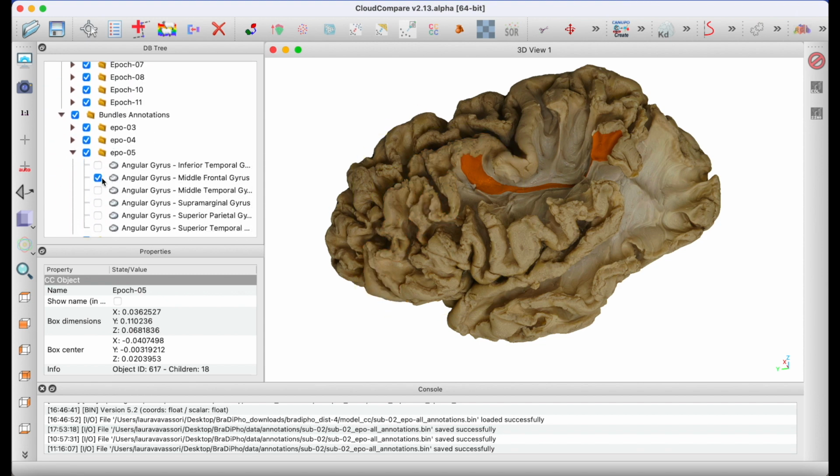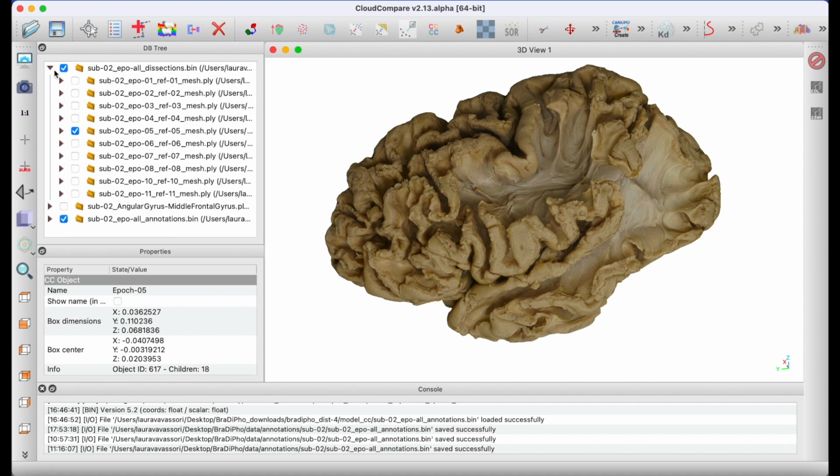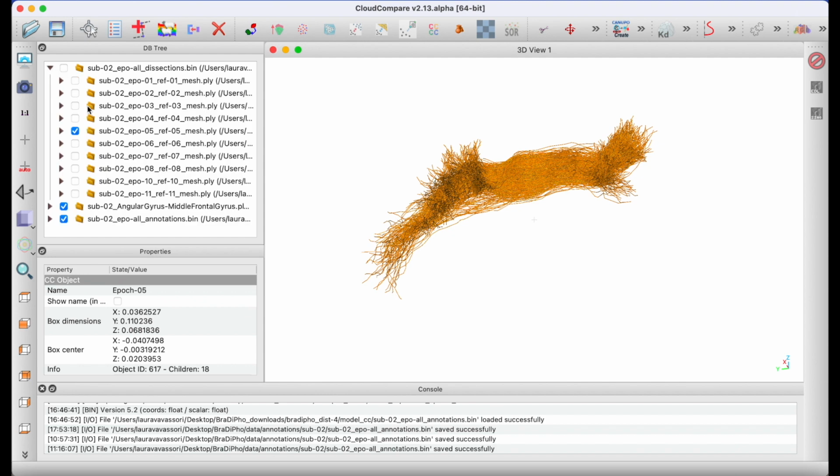Indeed, we saw that at this level of dissection we can extract the shortest, most ventral and lateral part connecting the posterior segment of the middle frontal gyrus to the angular gyrus. The question now is, are these longer fibers that I see in my tractographic reconstruction traceable in the real anatomy? Tractography gives me a precious information that actually should be considered while doing the dissection.